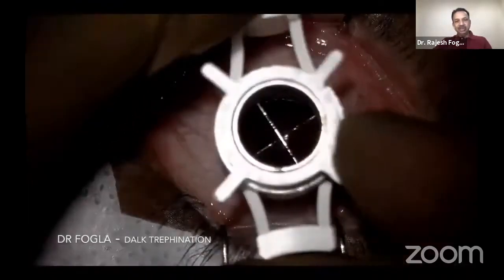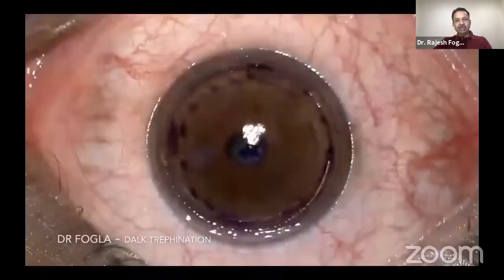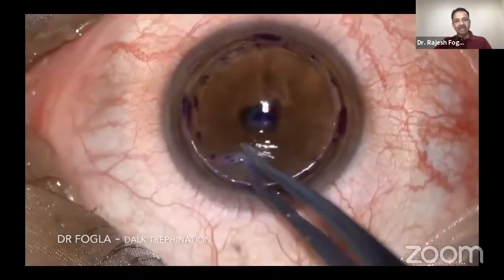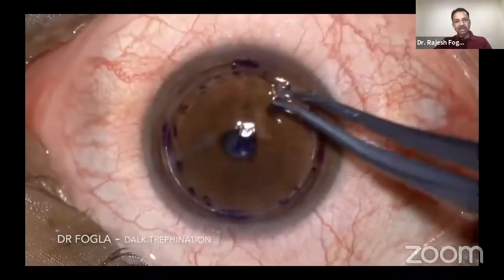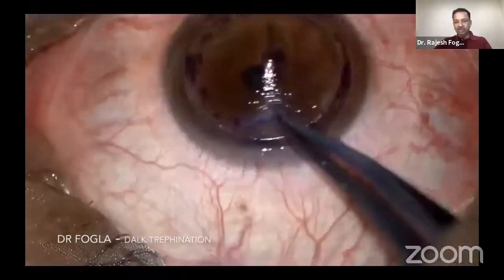So here you can see that we have gone about 7 quarter turns. So that's about 420 microns, but you see my cut has gone through those 4 marks that I made. And when you retract the cut edge, you can see that it's a fairly uniform cut all around, which is again the desired depth that you would want when you're doing a big bubble DALK.